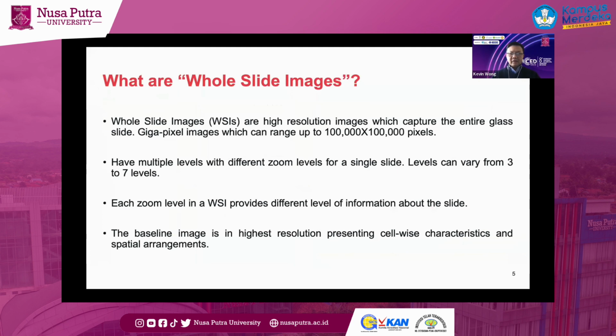So what is that? WSI, whole slide images, are high resolution images. They can capture the entire glass slide, and it's quite big. It is in terms of gigapixel images and can range up to 100,000 by 100,000 pixels. The good thing about the WSI format is that they have multiple levels with different zoom levels, just like the microscope. If some of you have used a microscope, you know that you can zoom in and zoom out. So there are different levels that you can zoom as well for the WSI, even though it's digitized. The levels vary from 3 to 7 levels, and each of the zoom levels will provide different information.